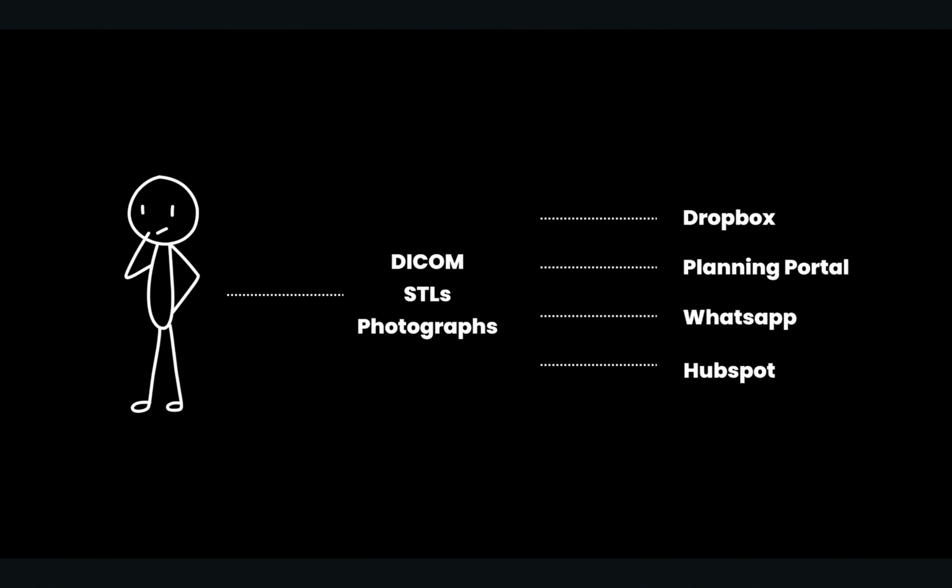And before I upload that into the planning portal, I realized that someone in the team hasn't uploaded some of the records for the Dropbox. So then I have to chase up where the diagnostics are. I then upload into the planning portal, and within the planning portal, I put my instructions of what I would like. I then message a WhatsApp chat, letting them know that I've uploaded into the portal and that I've put instructions in there so that they know to go look at it.